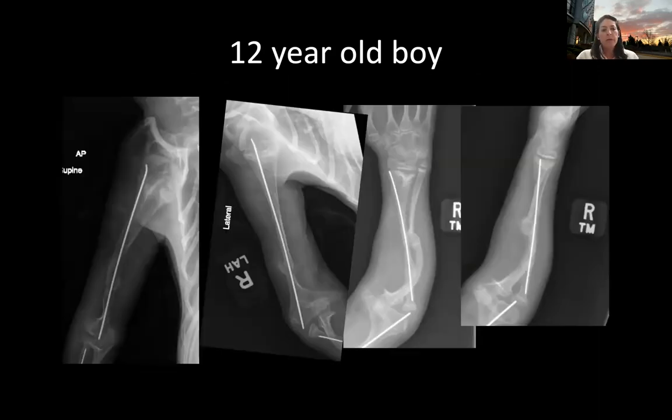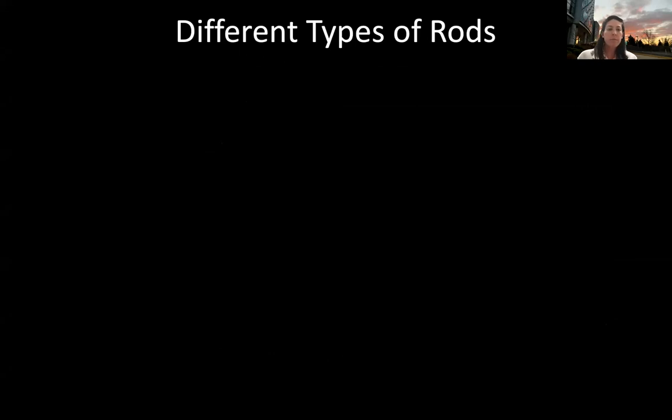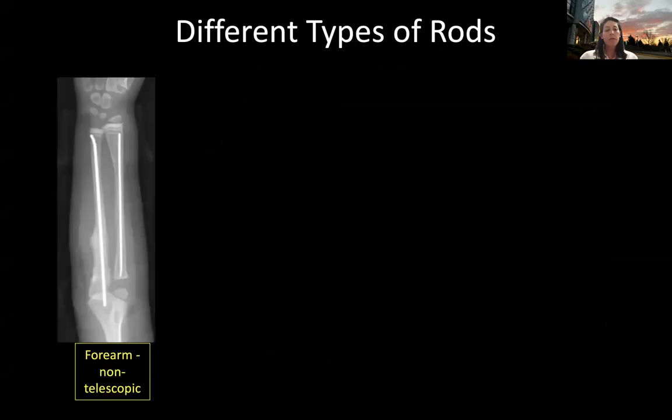This realignment and intramedullary rodding of both the humerus and the forearm, you can see the canals were not large enough to use a telescopic rod or even part of one. These are very small wires. We did not actually put one in the ulna after doing the rodding of the radius; it was the better part of valor to stop for the day. And these small rods have gone on to actually give quite a bit of stability and a more functional upper extremity. So there are different types of rods, as we've encountered already in these few case examples.